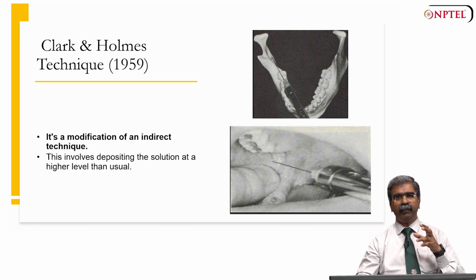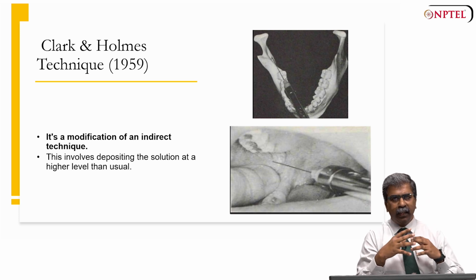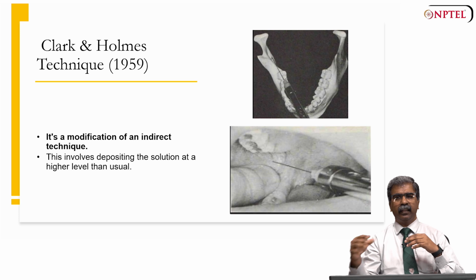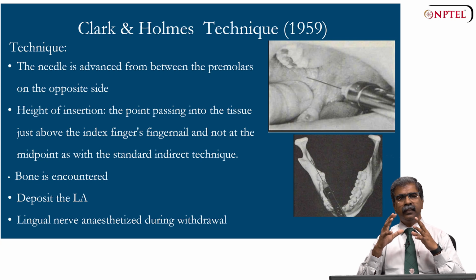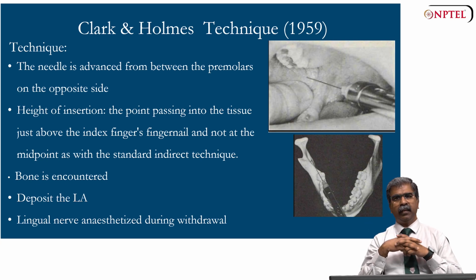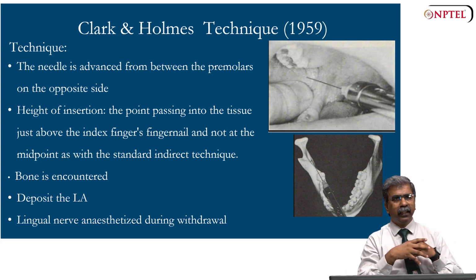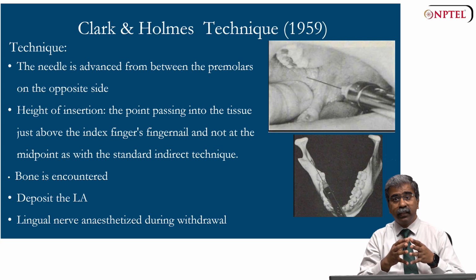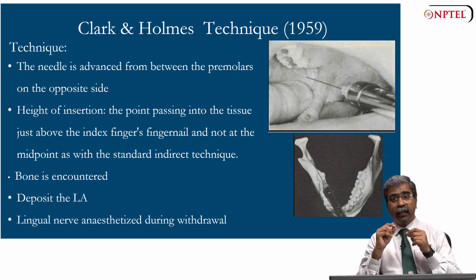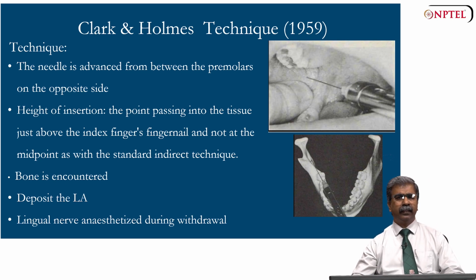And what are the advantages? The adjustments in the injection site can potentially lead to more consistent anesthesia of the mandibular teeth and surrounding tissue. Now let us see the technique. The needle is advanced from the opposite side of the mouth, specifically from between the premolars and the opposite side of the mandibular arch. And the height of insertion, unlike the standard indirect technique, the insertion point is just above the fingernail of the index finger, which is placed on the inner side of the ramus, rather than the standard indirect technique.